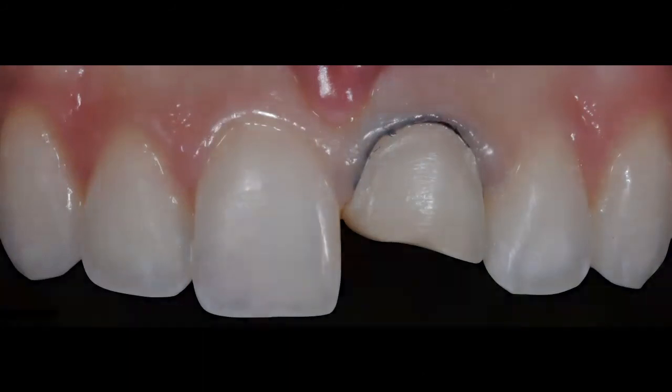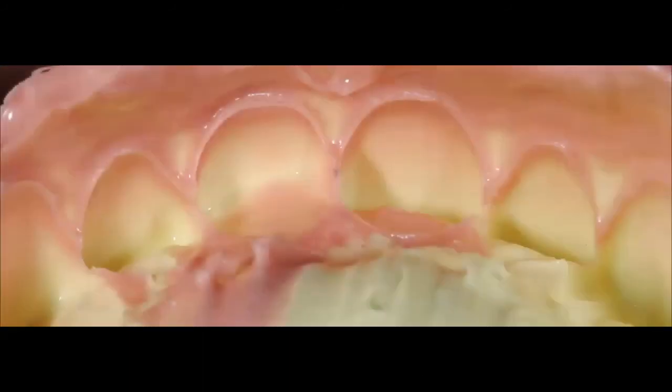And we chose for this particular case a feldspathic porcelain veneer, which is the oldest type of ceramic in my mind that we can use today, but it's a beautiful ceramic. Now, for these cases, why do I like feldspathic veneers? Well, there's a couple of reasons. They're very strong if they're bonded to enamel, and we had a lot of enamel in our substrate. But number 2, and most importantly, they're a beautiful restoration.